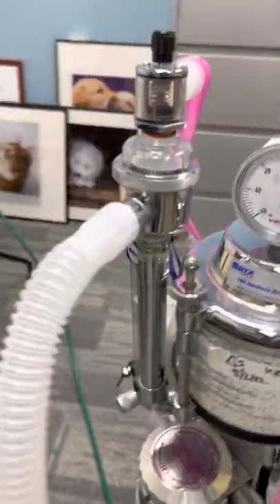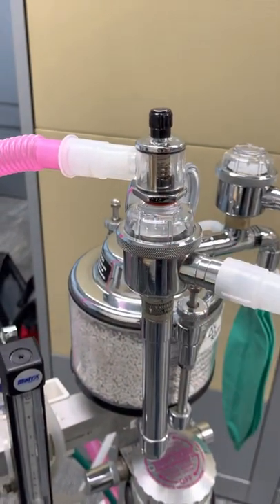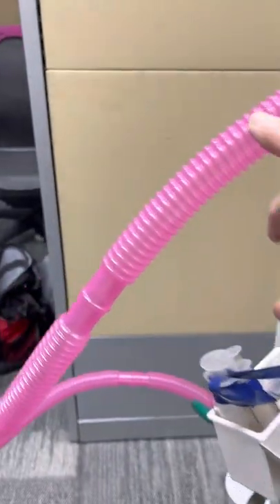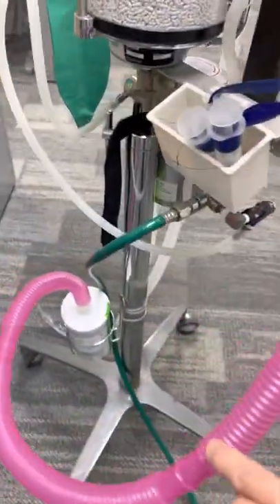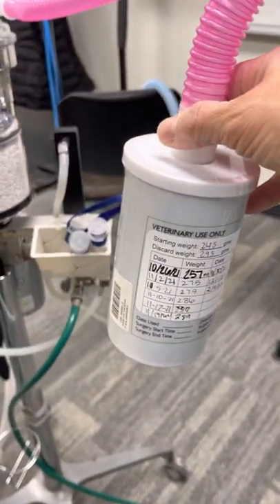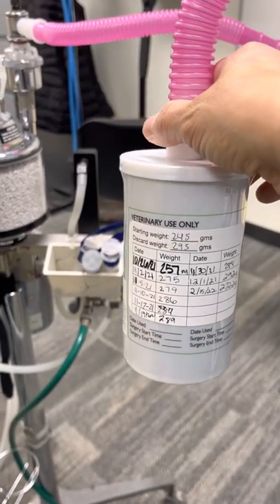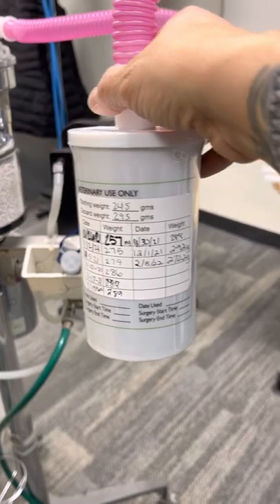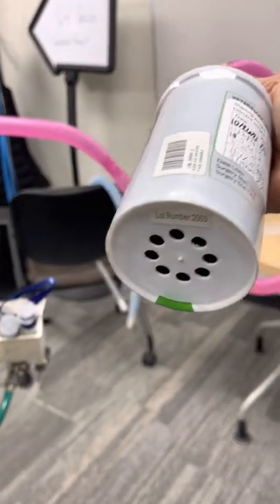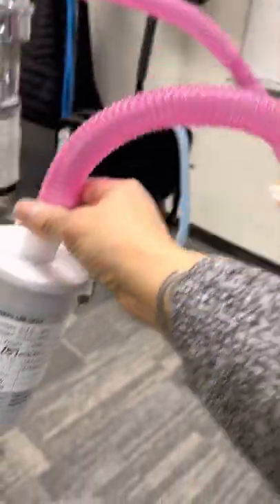Okay, let's go back to our pop-off valve. When the gas is no good, it's expired, it's done, it's not going to do anything else any more good. It's going to come out this tubing again down to this fresh air canister. And this canister then will filter that and then be pushed out into the room air. These are only good until they've gained about 50 grams. So we make sure that we constantly weigh them before and after every procedure. And you never want to occlude the bottom of these because this is where it's actually let out. All right.